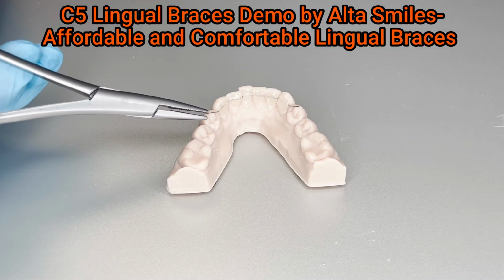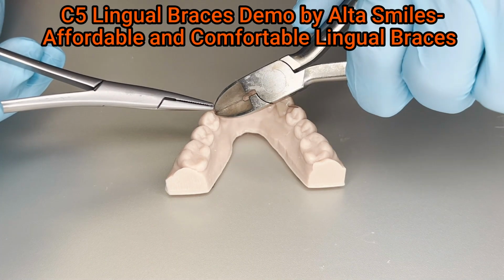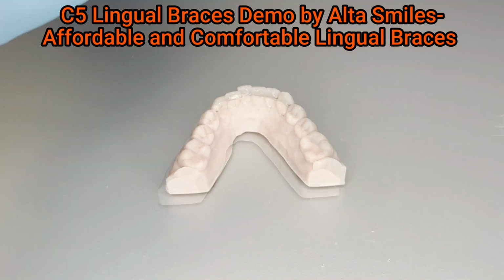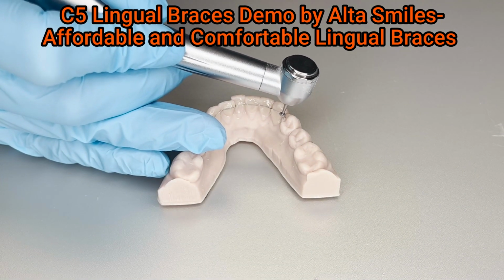While holding the terminal end of the wire with a Mathieu plier, trim the Pro wire flush with the composite. Finally, polish the ends of the wire for comfort.